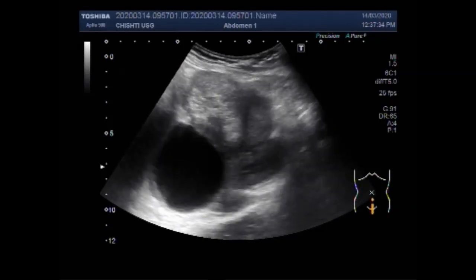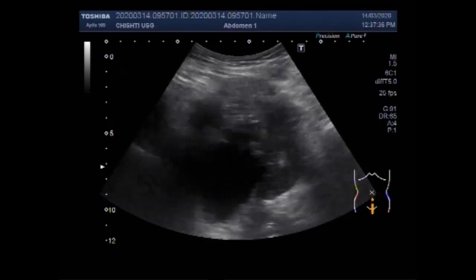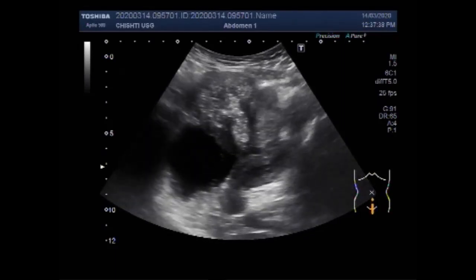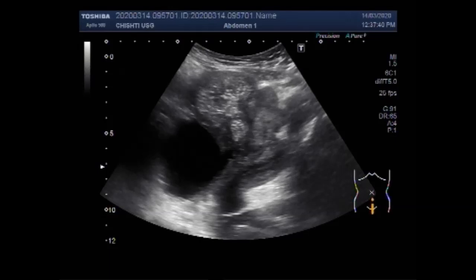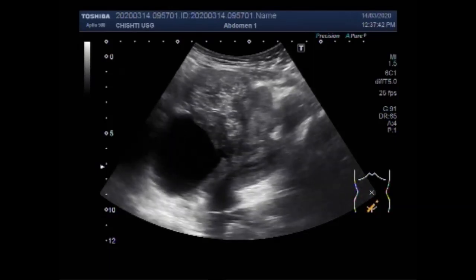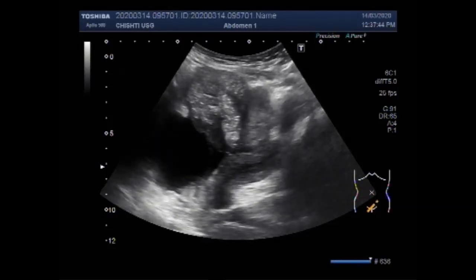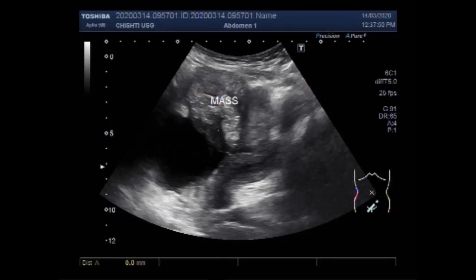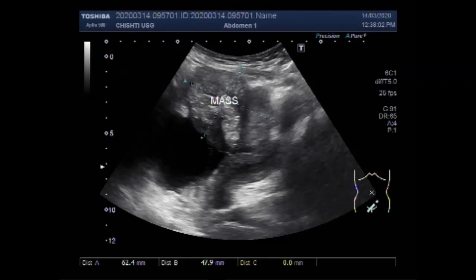You can see the mass lies outside the uterus; it is adjacent to the outer side of the middle and distal portion of the uterus. This complex mass measures 62.4 mm x 47.9 mm. Along with the left ovarian cyst, the mass is semi-solid to solid in consistency and has heterogeneous echogenicity — a complex mass.